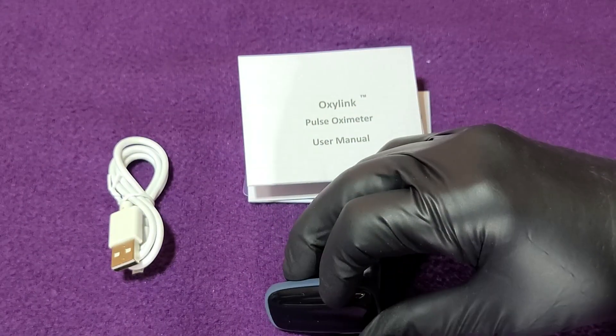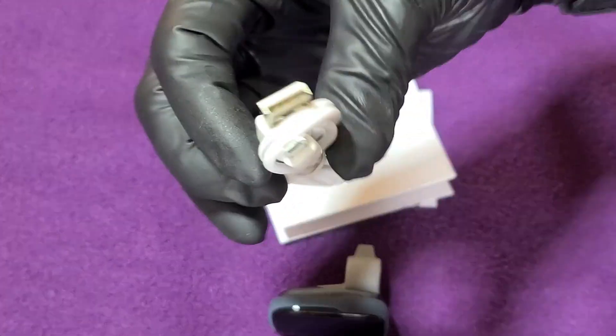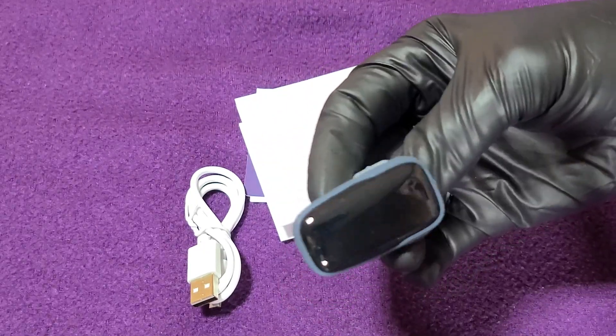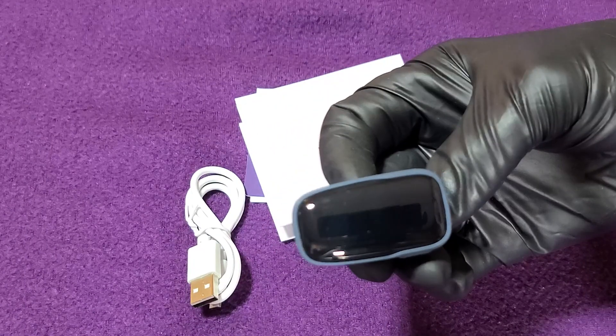No problem at all — I'm running Android right now. You get your little micro cord there. But I have got a watch that does the same thing this does.